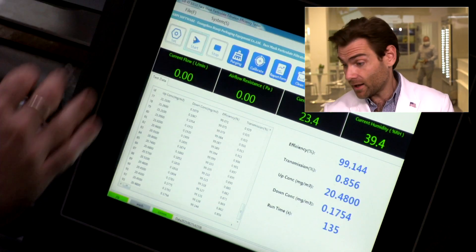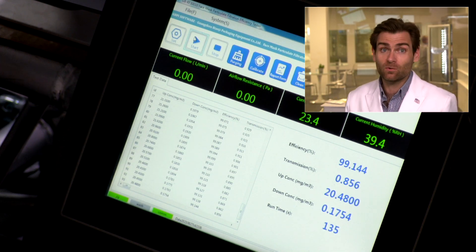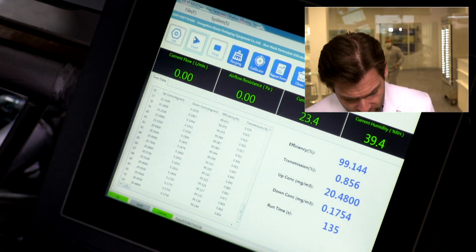Let's do it together, shall we? Let's count down — I got to hear you, you got to do it out loud. You ready? Three, two, one. See what I say? 99.144. 99.144 — that's a good mask.